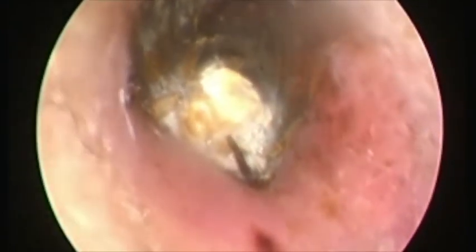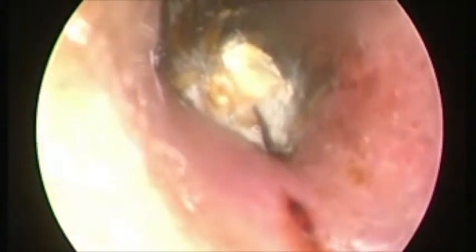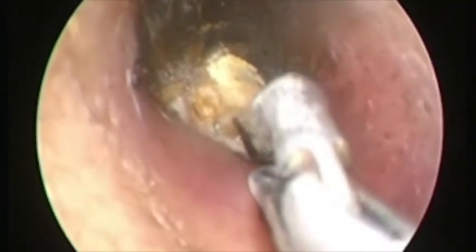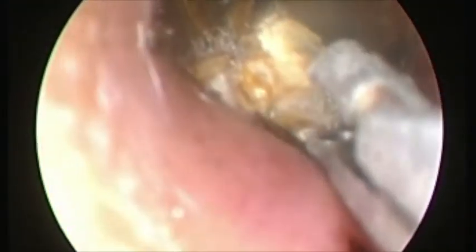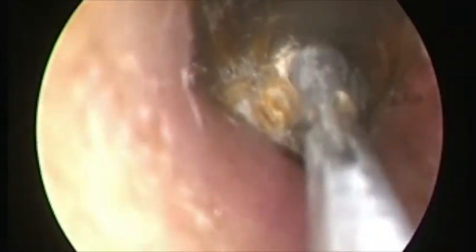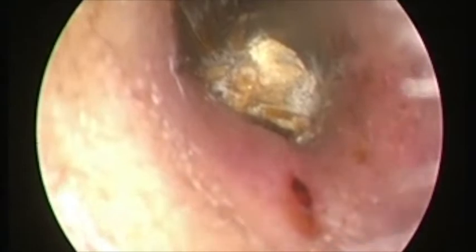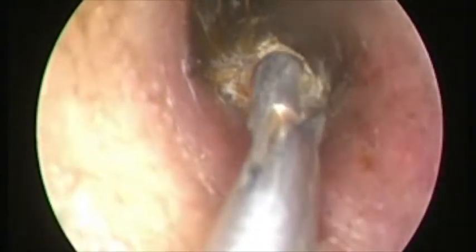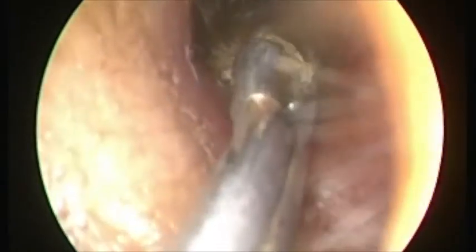Here we see the insect lodged in the left external auditory canal, completely plastered over the tympanic membrane and the external auditory canal. We are trying to remove it with cupped forceps. The challenge will be to find a plane between the foreign body and the external auditory canal and then remove it.